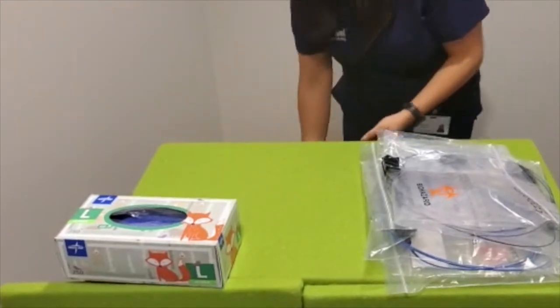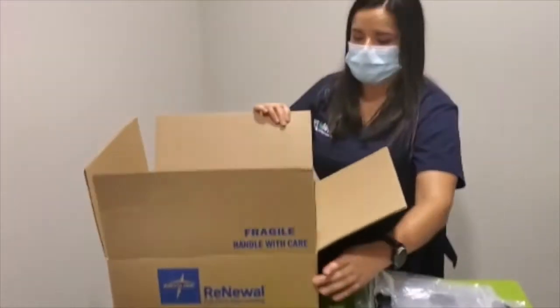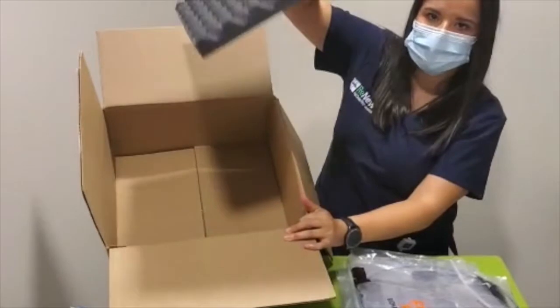You will need to have a square cardboard box built and lined with a piece of foam.